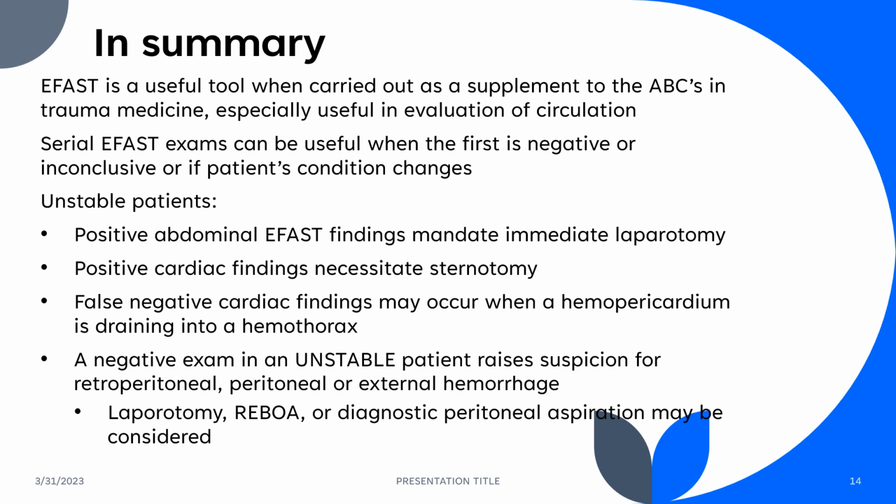Now, we do know that ultrasound takes a long time to learn and become competent at, much longer than most people appreciate. And so just because you get a negative, especially if you're early in your process of completing these exams, it doesn't mean that there couldn't be a small bleed or something happening there. So those serial exams will help provide optimal care, and they're very low risk to the patient. There's no radiation, they're very fast, they're inexpensive. It's really just finding the people that are qualified to complete them that is the challenge.